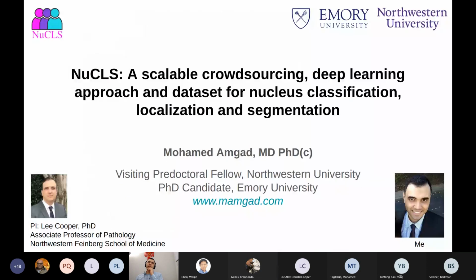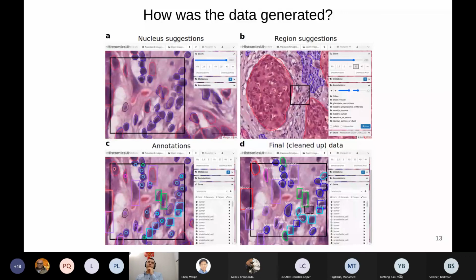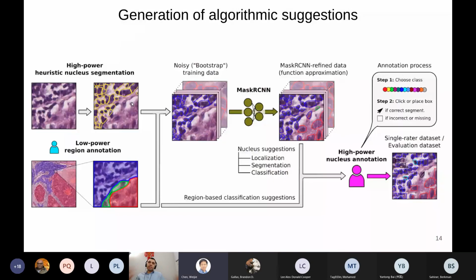These algorithms use all of the things that people use, and I forget the watershed and Gaussian and Otsu thresholding and so on. But really, it was to showcase the potential of this approach. We really use a weak algorithm here, and the Mask R-CNN is doing a lot of the heavy lifting in terms of detection, improving the detections. Maybe segmentation, and maybe the classification, not so much, but yes, it is algorithm-driven for sure.